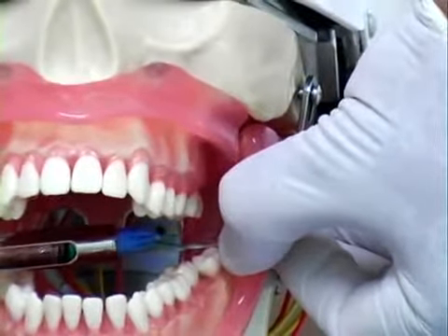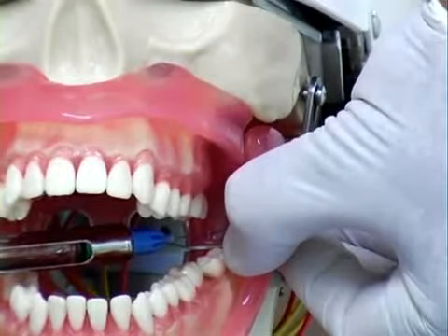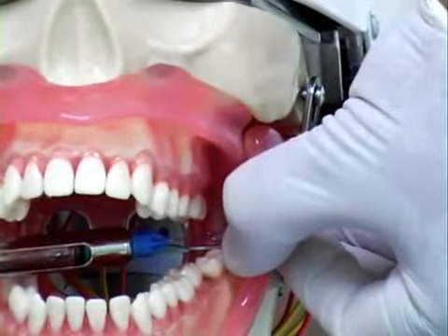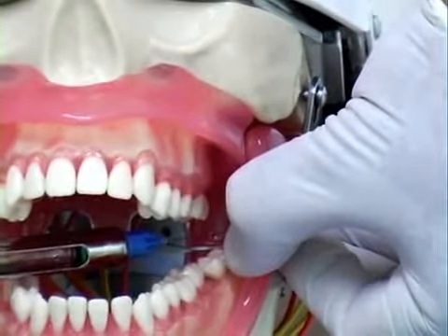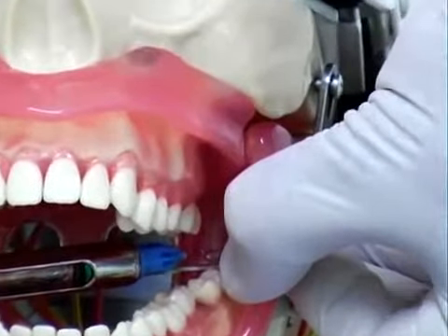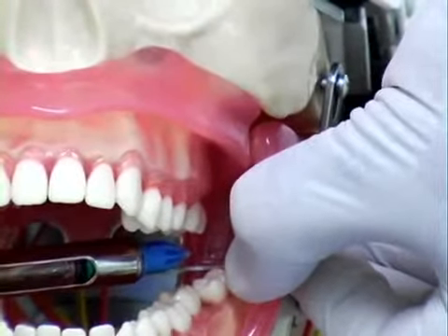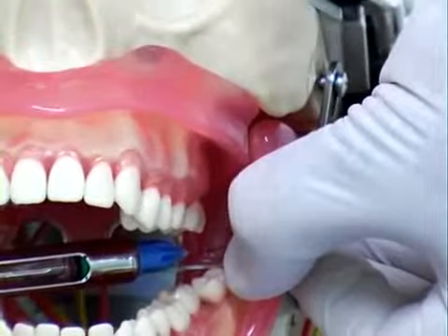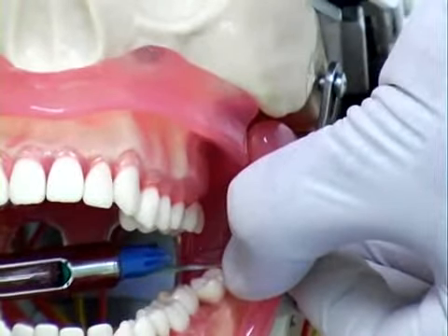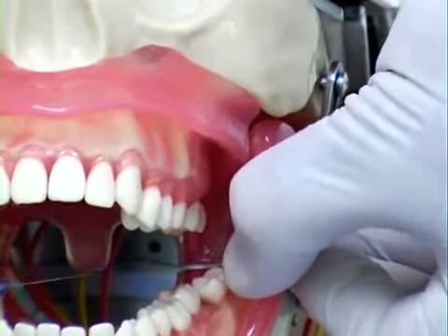Or if you touch the bone too early, before inserting the needle up to 20 millimeter, then you have to alter the position of the needle until you don't feel any resistance up to 20 millimeter. Once you are in correct position, then you have to deposit the whole of your cartridge and then gently withdraw the needle.